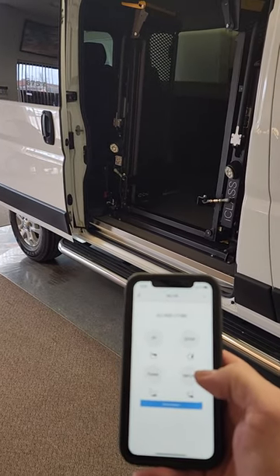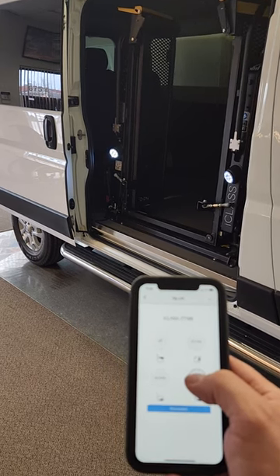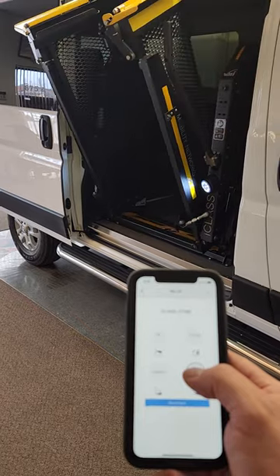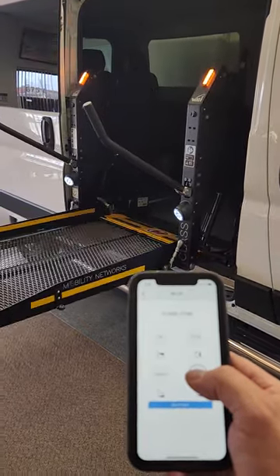I'll use my cell phone to deploy the lift. First I'll press deploy. Now the deploy will go out to the level of the floor in the vehicle.